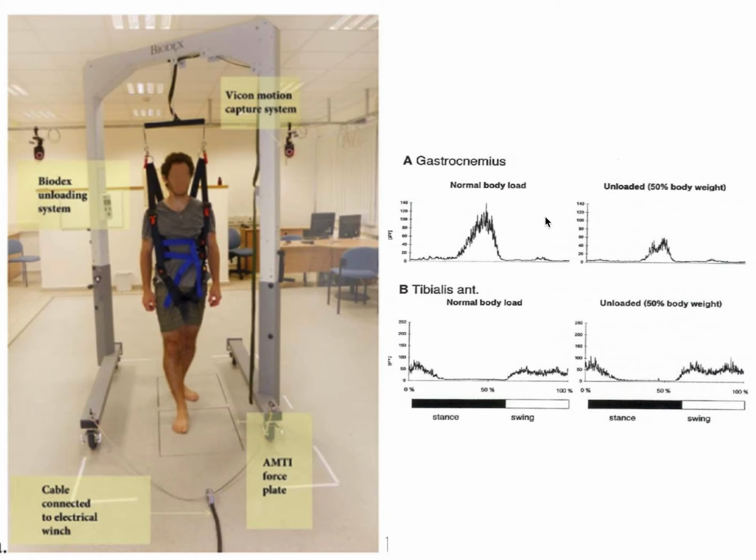And you can see for gastrocnemius, the activation amplitude just decreased, and that's obvious, right? But for tibialis anterior, I would say that muscle activation didn't change much in terms of the amplitude. Even though it seems a little bit higher, it's hard to tell. So I would say it remains the same.